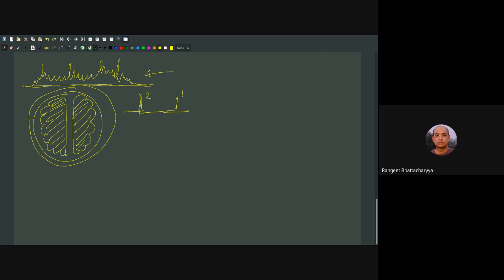Okay, so I move on to what I was saying earlier. We have two graphs now, the T2 graph. I'm plotting magnetization in a suitable direction, the magnetization decaying at two different rates depending on where we are looking. If we have deoxygenated blood, then it decays faster. If we have oxygenated blood, it decays slower. But how does that help record the image?